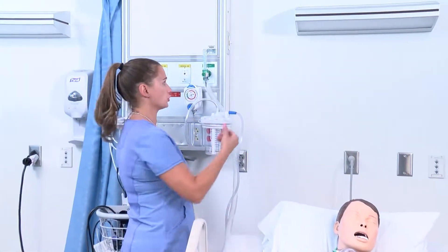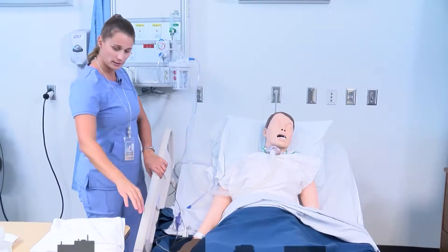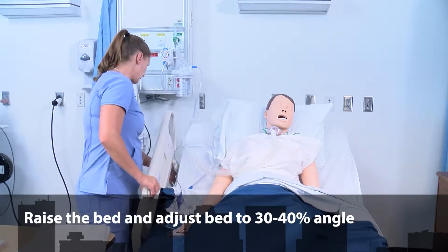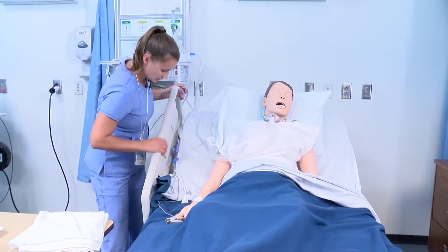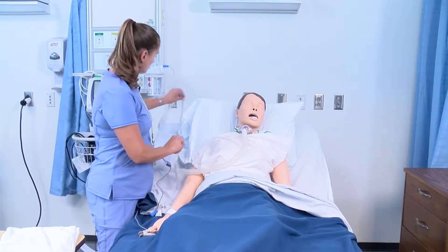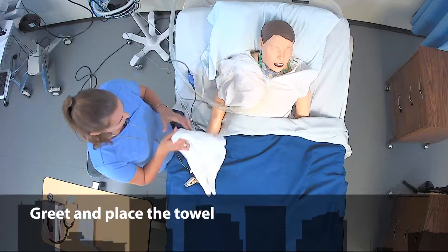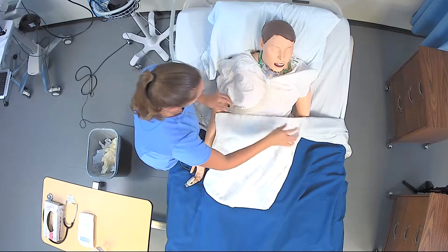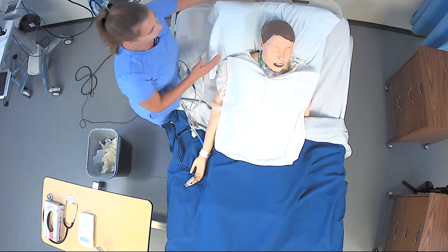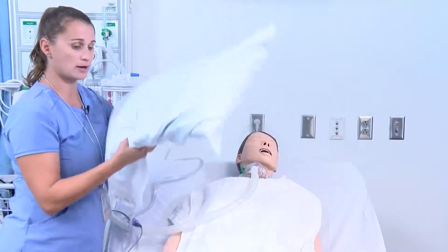I'm going to raise the bed to a comfortable working height and make sure the patient is at a 30 to 45 degree angle, then put the bed rail down. This will help me avoid inadvertent contamination during the procedure. I'm going to place a towel underneath the patient so that any secretions won't soil their gown, and I'll lift the pillow from behind their head so I have full access to the tracheostomy site. I'll place it back when we're done.